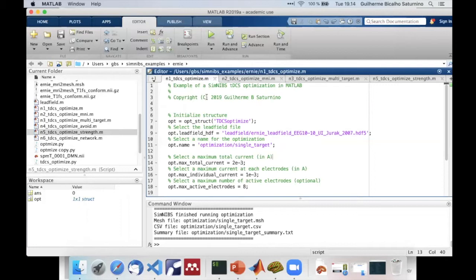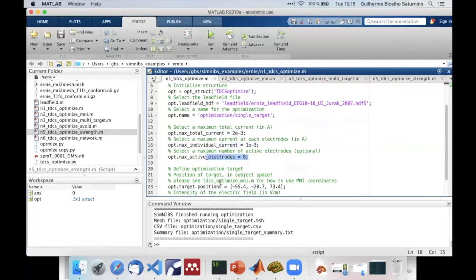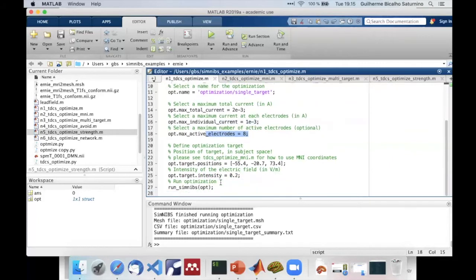SimNIBS offers an easy-to-use yet flexible interface to set up the optimizations. Here you can see I start by selecting a previously calculated lead field and a name for my optimization. I then go on to define the safety constraints: a maximum current I can inject in total, and the maximum current I can inject through each electrode, as well as a number of active electrodes, which correspond to the number of channels in my multi-channel TES system. Finally, I define my target position and the intensity of the electric field at the target.